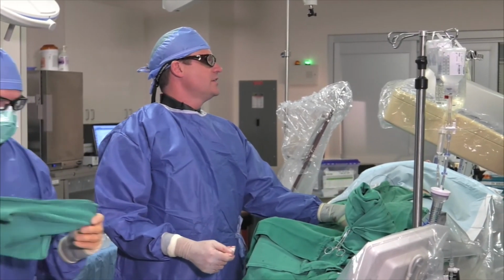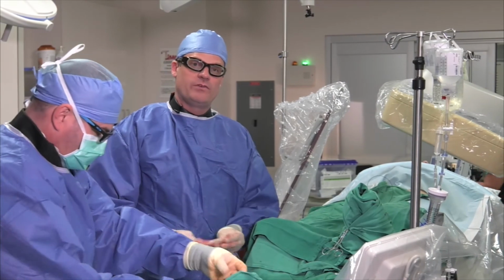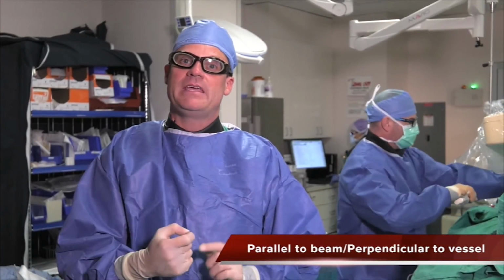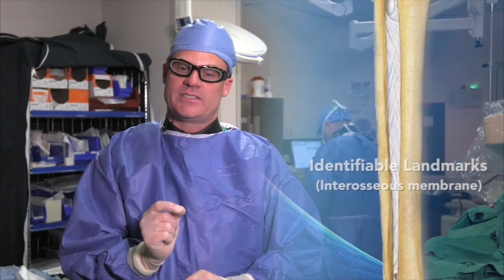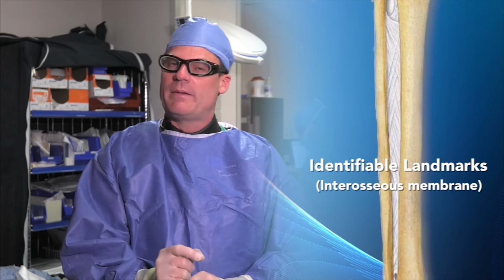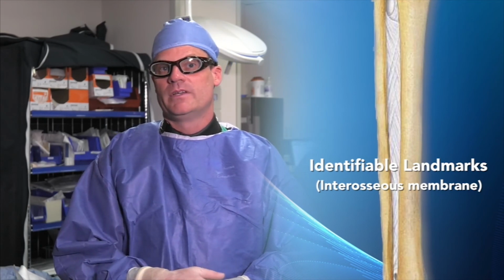Did you get this, Dave? Yeah. Peroneal access in place. It was pretty straightforward. It took us less than 10 seconds to get it. Remember, the needle should be parallel to the beam, perpendicular to the vessel. You'll hit the interosseous membrane, which will be your first pop, and then right behind the interosseous membrane is the peroneal. Again, this is a great technique, and everyone should become versed at it, especially from an angiographic approach. It's very difficult from an extravascular ultrasound approach to visualize the peroneal. So again, angiographic visualization and understanding this technique is important.